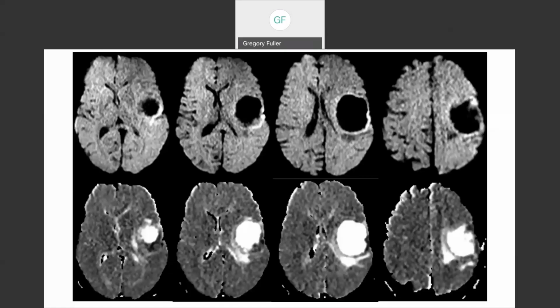Okay. Now, the point is that there is no restricted diffusion. See how on the DWI, see how dark the cyst is? So there's no restricted diffusion there. There is restricted diffusion in the wall, right? In that irregular area. Can everyone identify that? All right, let's see. See right here and right here and here. And sure enough, let's just take this one. When you go to the bottom, you look at the ADC map, the apparent diffusion coefficient map, and sure enough, it's dark. It's hypointense.